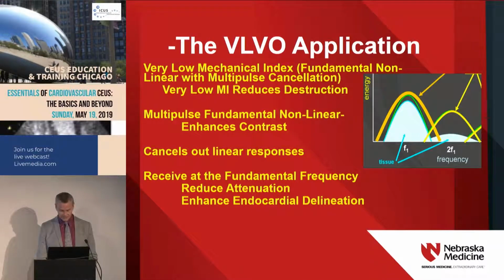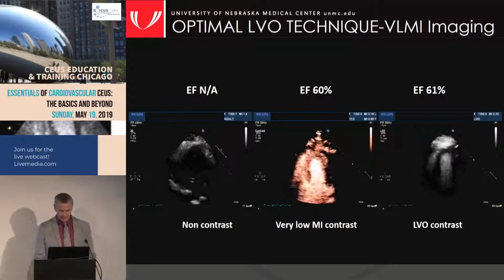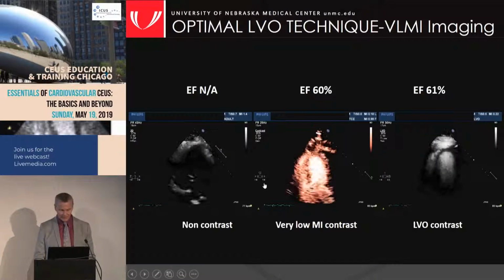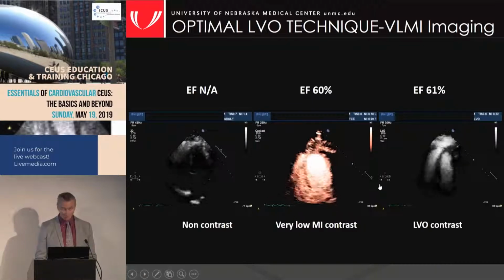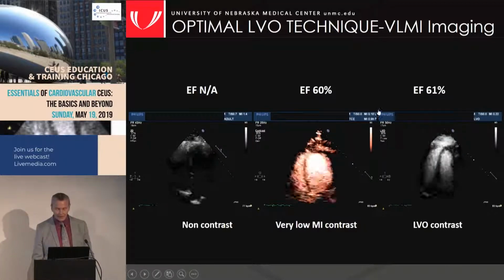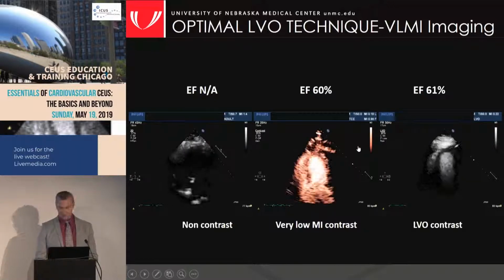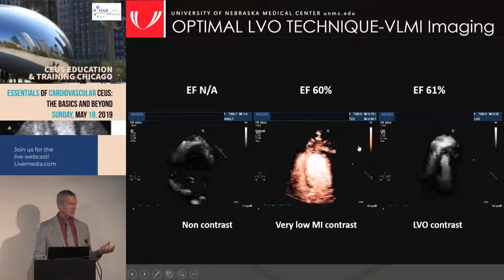Yes. When you go back to that, again, can you point out your frequencies? There you see it's transmit at 1.8 megahertz. It's very hard to see, but it's transmitting at 1.8 megahertz and receiving at 1.8 megahertz. All right. Here, now, this is software, Tom, that is not just simply your MI is low. The MI is at 0.18, right here, 0.18. See that? There it is right there. But this is additional software in all the machines. All the machines, yes. Not standard. Well, it's apparently not standard, but it's been around since 2000.